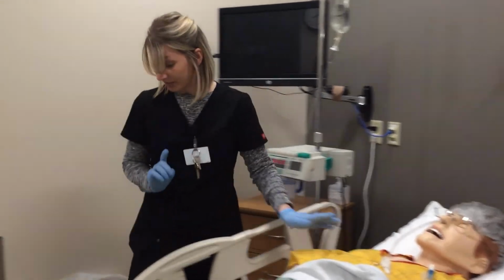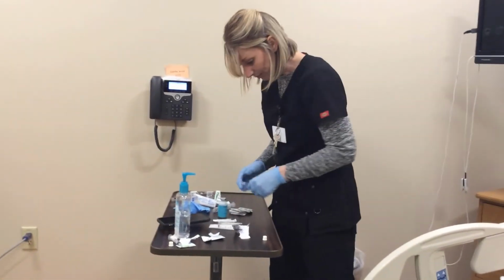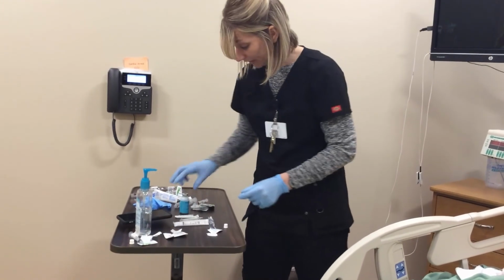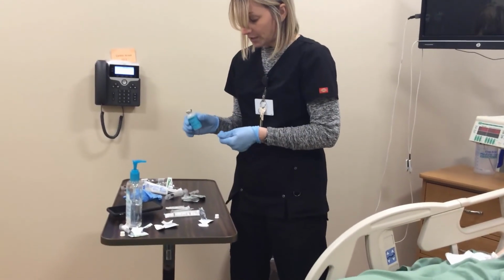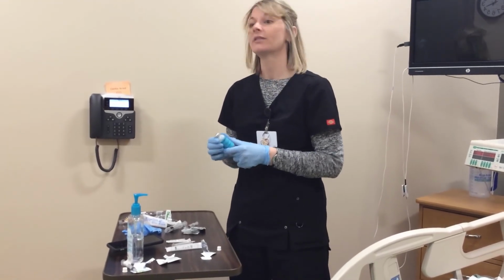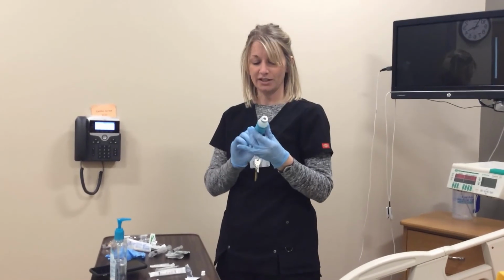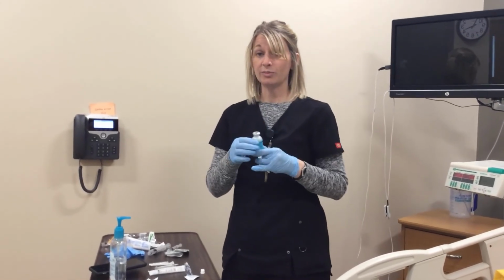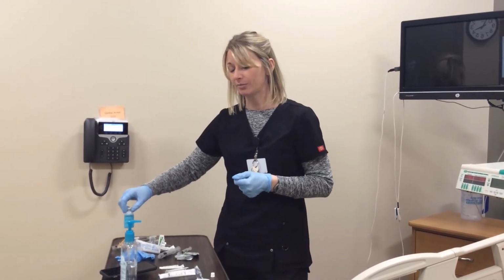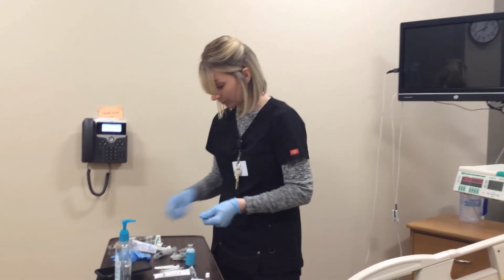Good. So then what I need to do is I need to clean up my mess, obviously. Any kind of sharps containers, you go into sharps. We've already done my waste appropriately. If you've got like a bigger vial, make sure that you check whatever the policy is at your facility, because certain medications go in certain containers. Like at the area, they've got a black container, a blue container, a red container, a yellow container. So depending on the medication that you give, you want to make sure you put it in the appropriate bin if you've got any left in it so that it gets disposed of properly. And the rest I'm going to throw away.